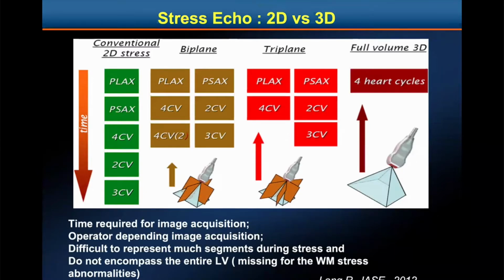3D echocardiography is also possible to use in stress echocardiography for our patients. The time required for image acquisition is very short.